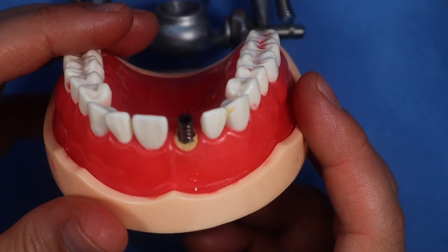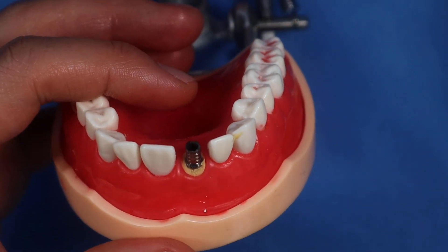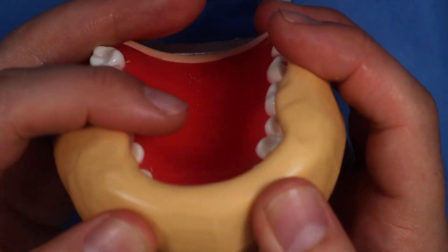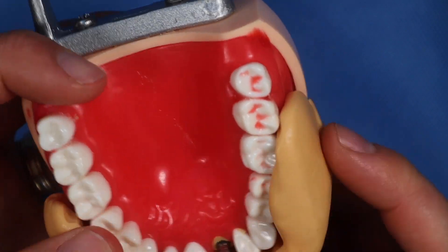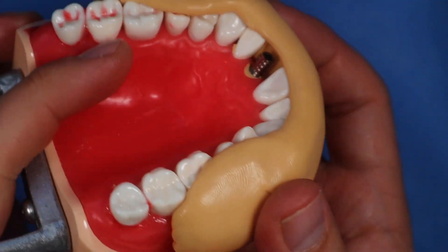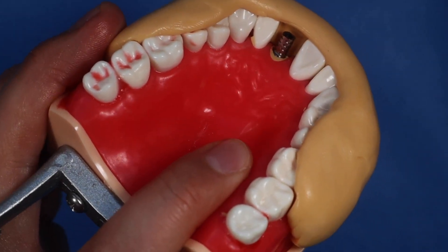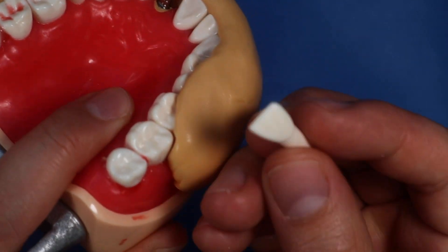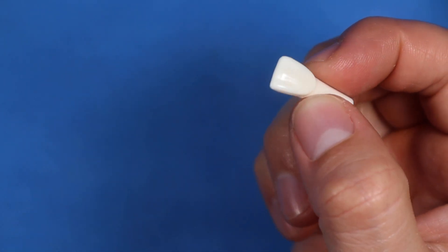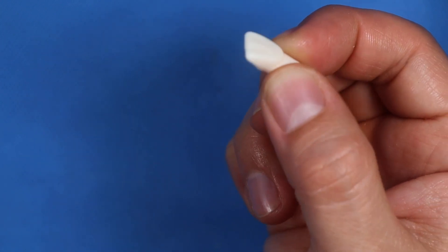In this video I'm going to show you the other way — not the vacuform material way. We have a nice intact tooth, so we're going to use the putty matrix. We're going to take this tooth and cut it with the disc so just the crown comes off, and then put that into the putty. Let's do that right now.